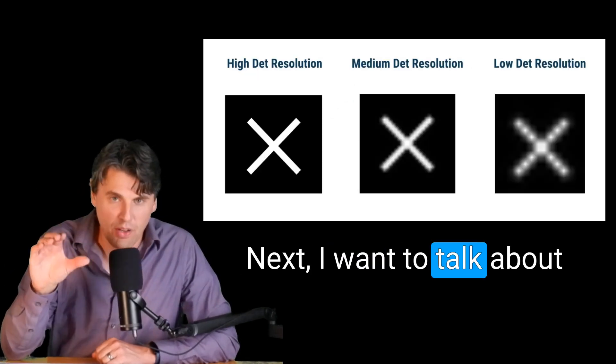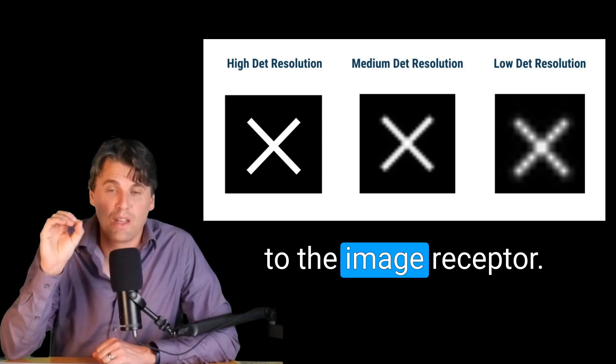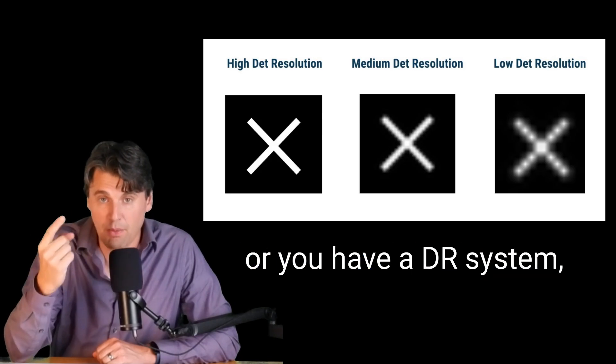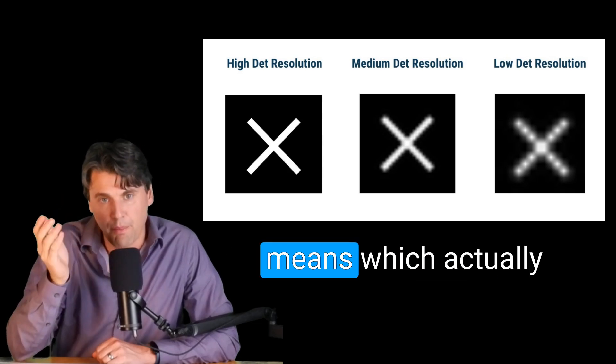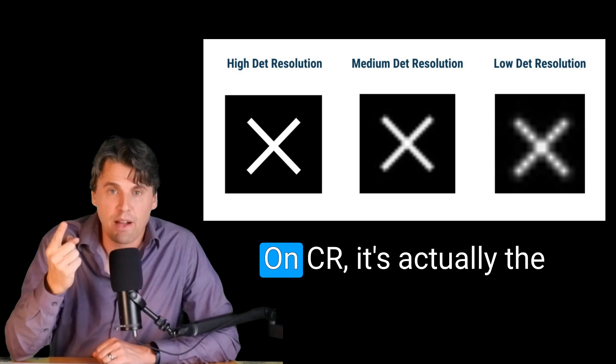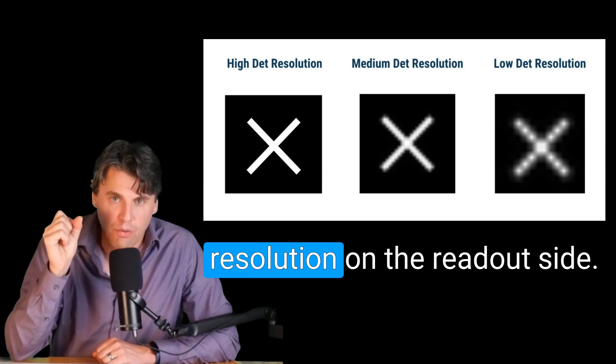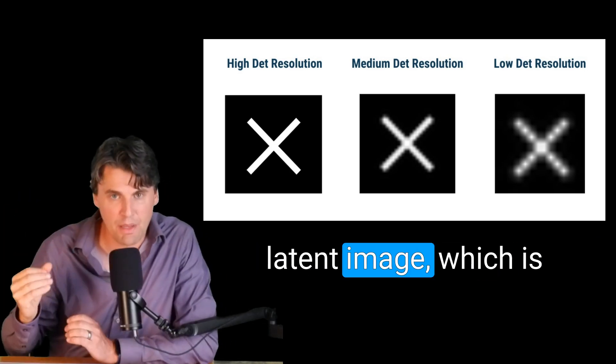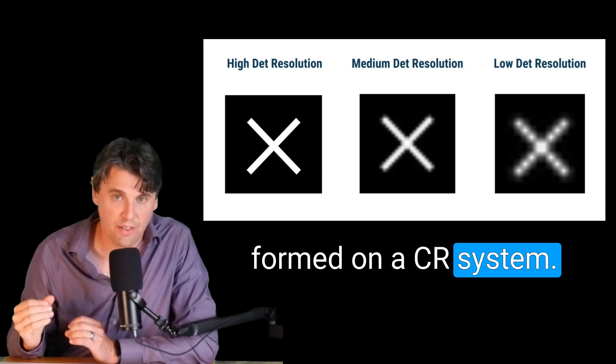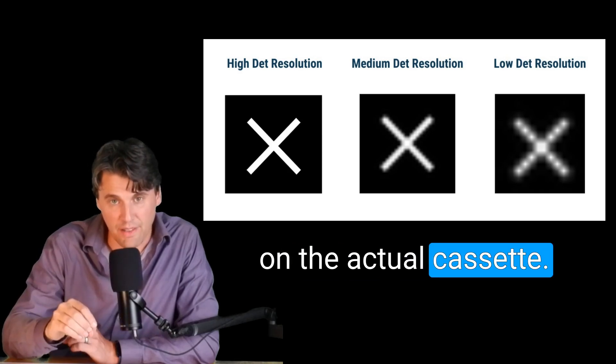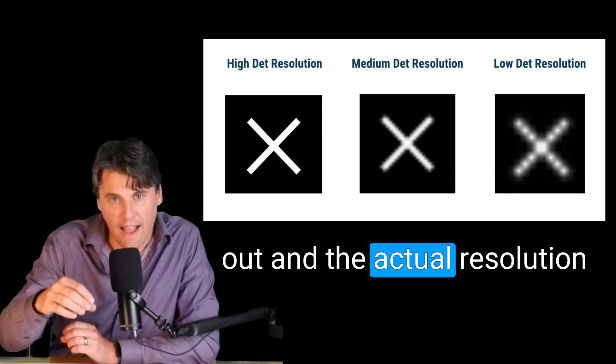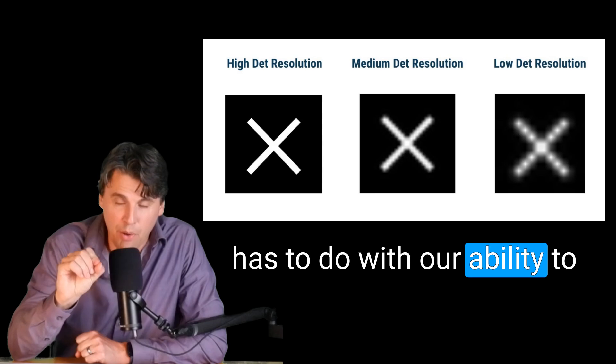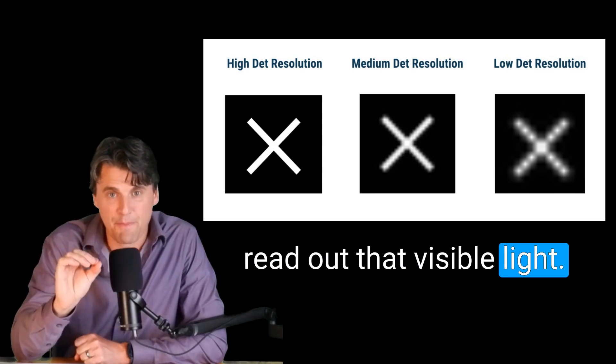Next, I want to talk about the resolution effect due to the image receptor. If you have a CR system, or you have a DR system, they will each have different means which actually limit the space resolution. On CR, it's actually the resolution on the readout side. Again, you have your latent image which is formed on a CR system. And as that is read out, the laser is being shined on the actual cassette. The visible light is coming out and the actual resolution has to do with our ability to read out that visible light.